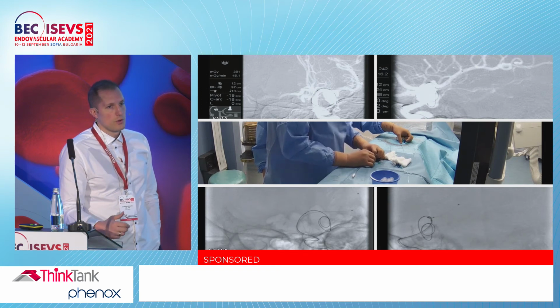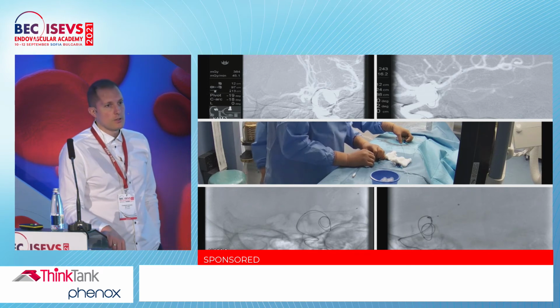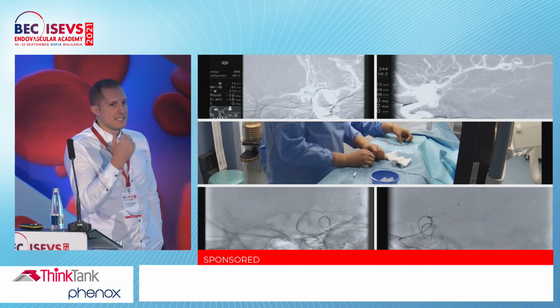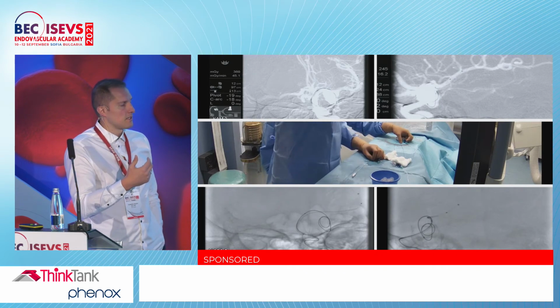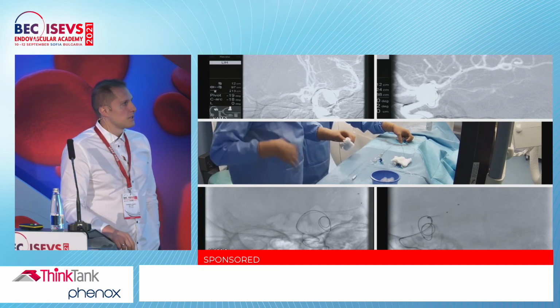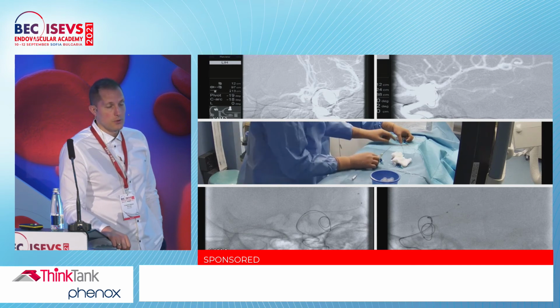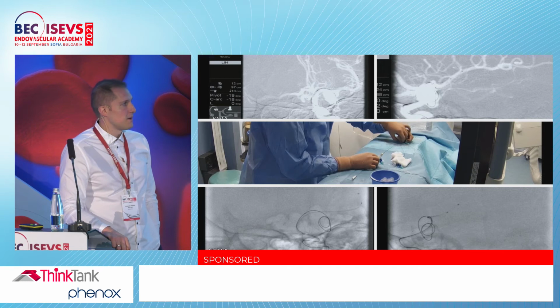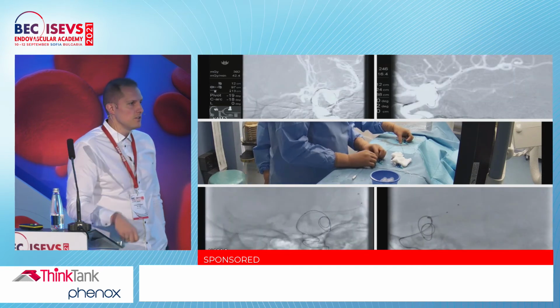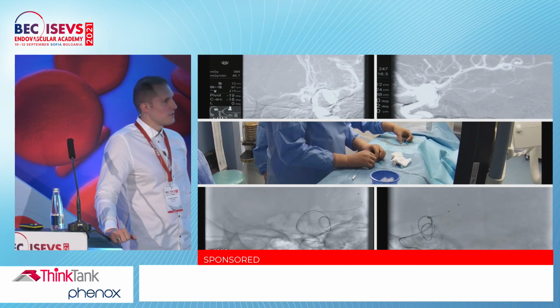So we are not very experienced compared to Professor Henkes. So I cannot guess, if it's unconstructed inside the catheter, where I should start with the stent, so to be completely sure where I will finish. On Thursday, we performed a case together with the professor. He taught me some tips and tricks on where I should observe and watch inside the microcatheter, so I can guess almost correctly where you finish. But I won't share it with you. It's only for me.